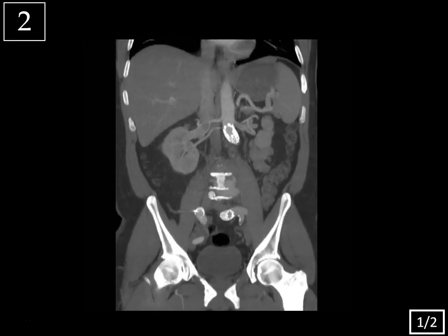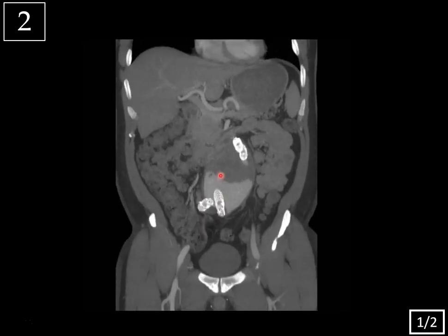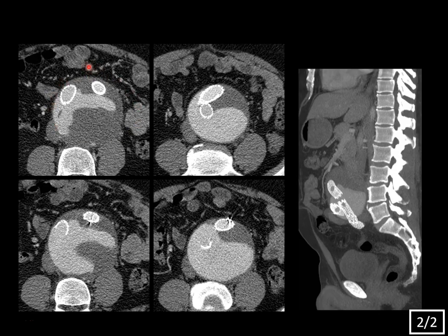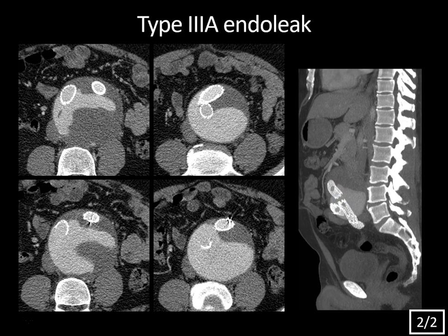Looking further at the graft, you can see there's a disconnect at these two modular components. The axial images show again this large abdominal aortic aneurysm status post endograft repair, with the right limb and the left limb visible. Contrast within the excluded sac tells you there's an endoleak, and you can see the actual disconnected limb where the contrast is spilling out into the aneurysm sac. This is much better seen on the sagittal reformatted image, which confirms the limb is disconnected. This is typical for a type 3a endoleak.